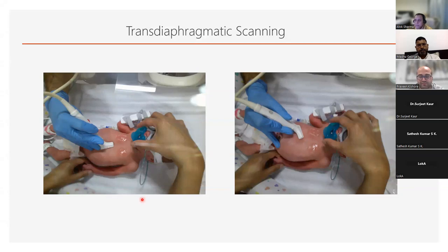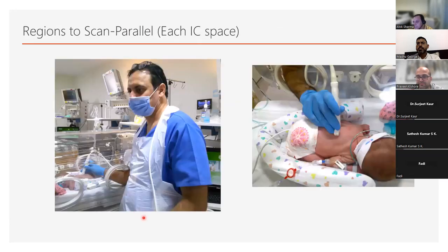I'm sorry, Sharma, just a quick question, please. Yes, please. So for the parallel scanning, we always point the pointer to the right side, whether it's in front or at the back. Yeah. Thank you.